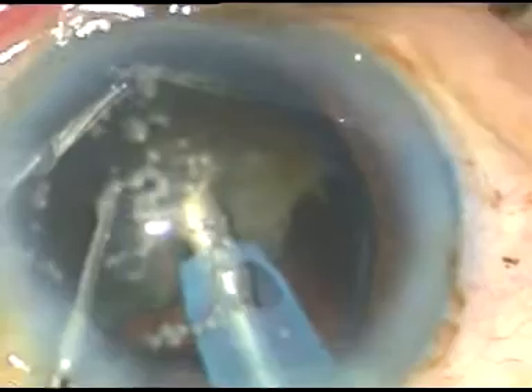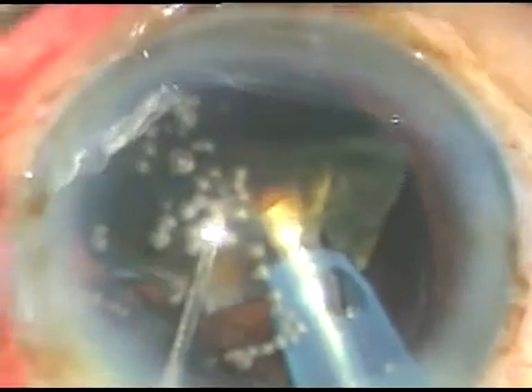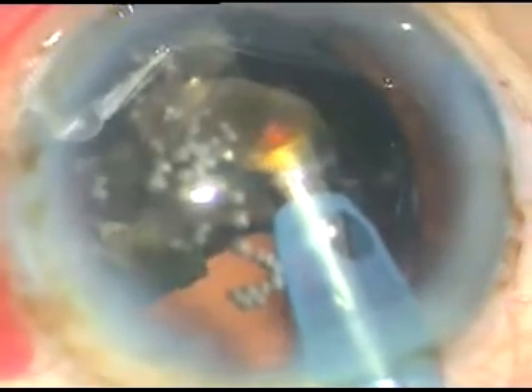I have counted in this case there are about 50 air bubbles sticking to the corneal endothelium, and they are not moving — like 50 soldiers standing in different rows to protect the corneal endothelium. You can see the air bubbles are not moving.